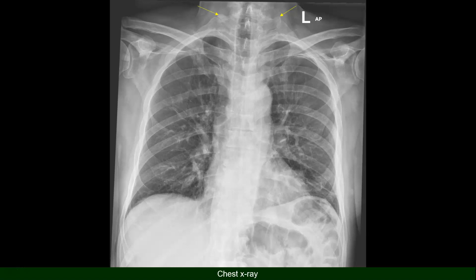The first hint we can use to diagnose osteosclerotic metastasis on chest X-ray is to compare a certain bony structure to the contralateral site. Here we see increased bone density of the right transverse process of the first thoracic vertebra, increased density at the root of the spinous process of the right scapula compared to the left, and increased density of the lateral part of the right clavicle compared to the left.